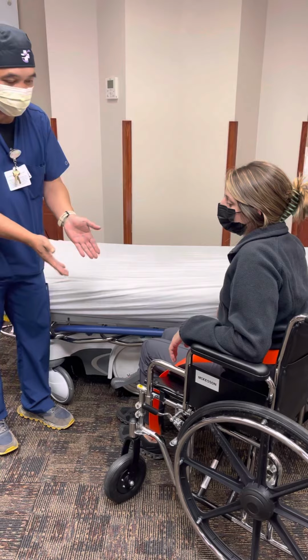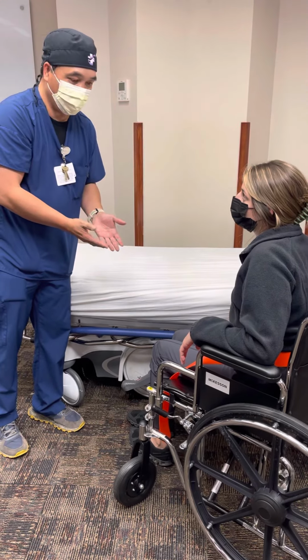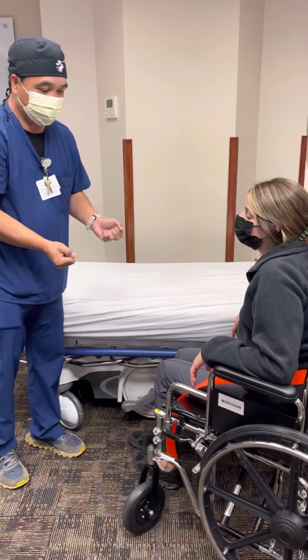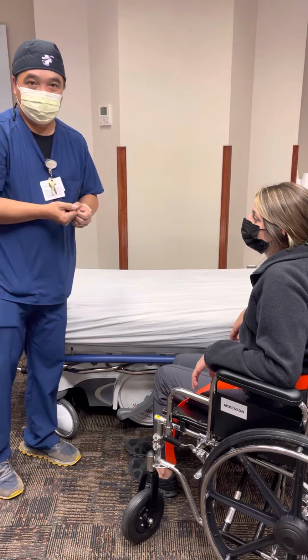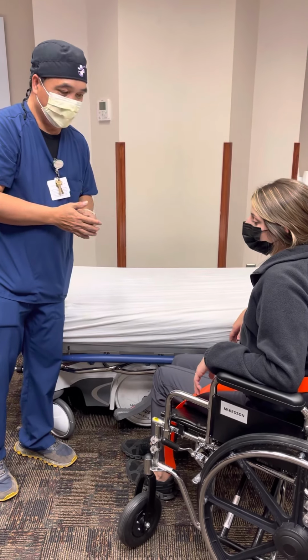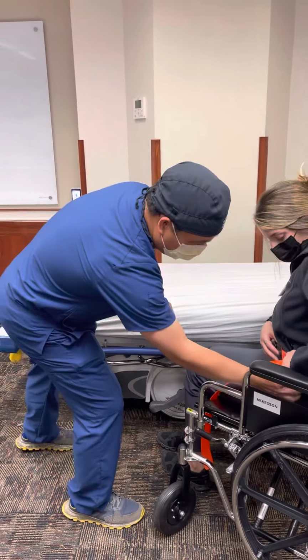So ask the patient, tell the patient what you want her to do so she can help you out. That's the main thing. Don't make it harder on yourself. For all we know, the patient can stand up and do it on her own. Then grab and pull if possible. Minimize that as much as possible. So that's the transfer. Now I'm going to show you how to use the lift.